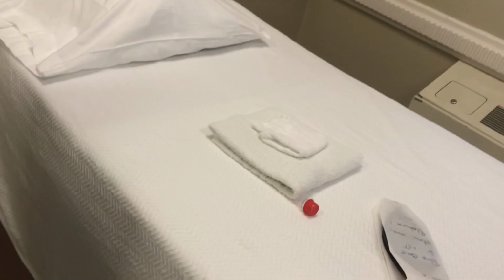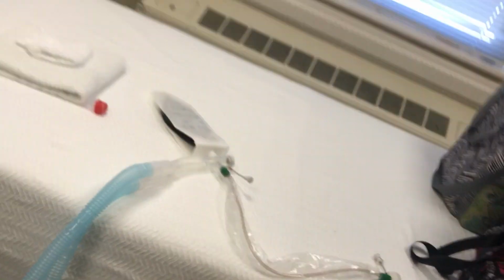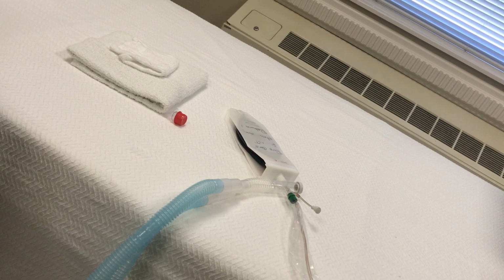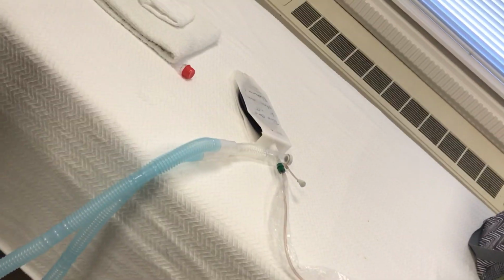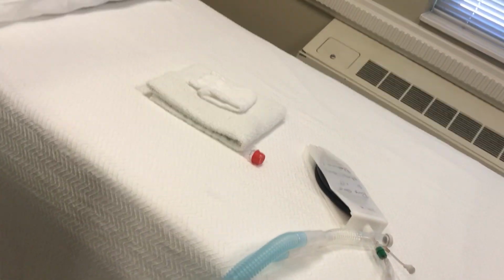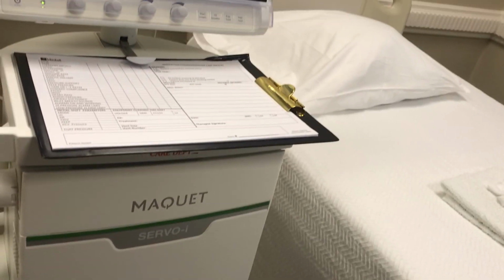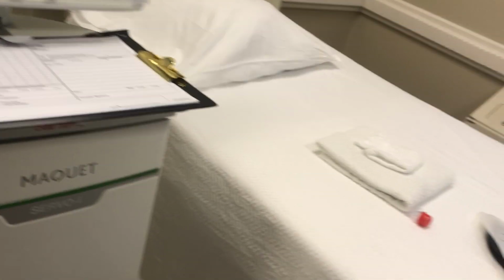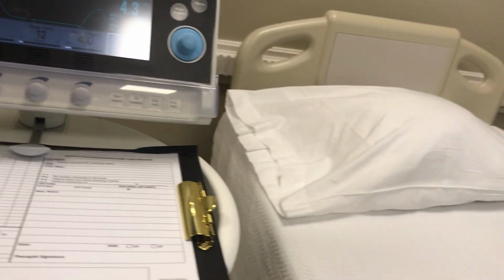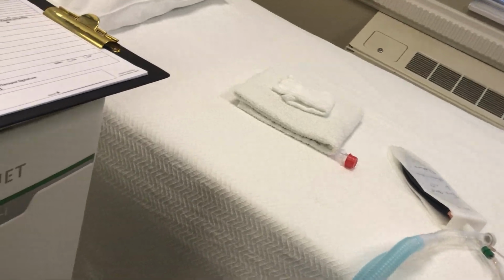Now I'm going to show you how to do the ventilator patient check. Of course, I'm going to walk in my patient room, get gloved or sanitized and gloved, because I'm going to be checking the patient over, assessing the patient, assessing the vitals. Then I'm going to come over and introduce myself first to the patient and family, if there's any family in the room. So then I would assess them.